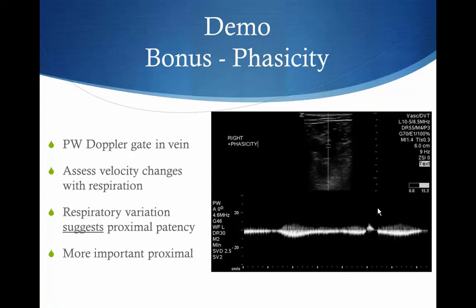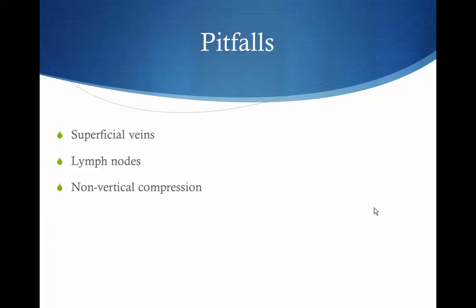Especially make sure they're laying flat. If they're sitting up at 90 degrees, you might lose a lot of this. Now just a couple of these, so that was it. That's pretty much how you do the study. You can see that is really pretty easy.